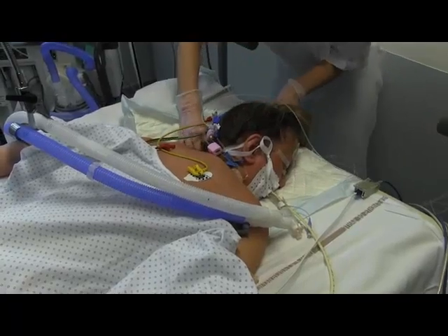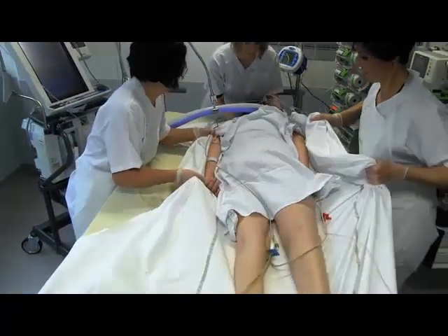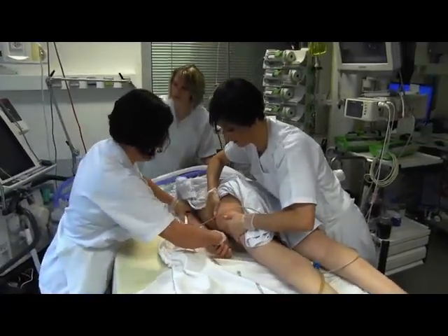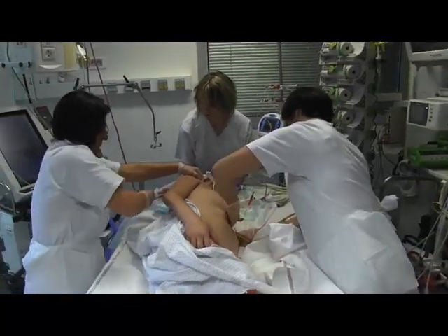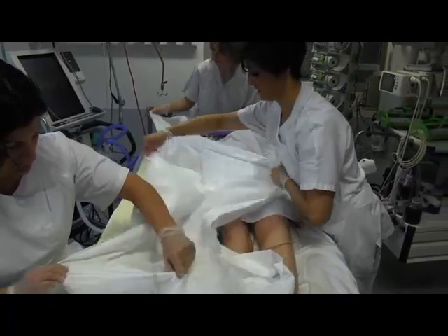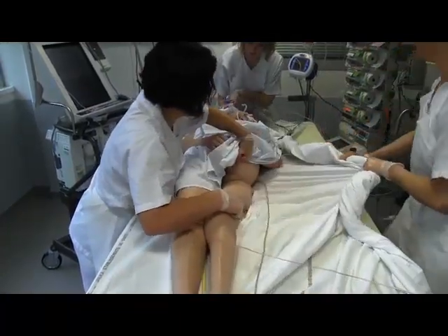To move the patient from the prone to the supine position, the steps are as follows. The first step is to move the patient horizontally towards the center of the bed. The second step is side lying on the same side as in step 3 of the proning procedure. The patient is maintained in this position for a short time while one person removes the electrodes from the posterior thorax and another person attaches the new electrodes to the torso. A new bedsheet is also prepared along the length of the bed. The third step is complete supine positioning, using the new bedsheet to pull the patient into the final complete supine position.